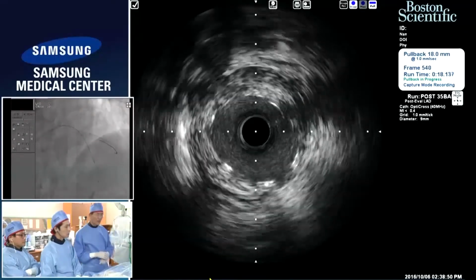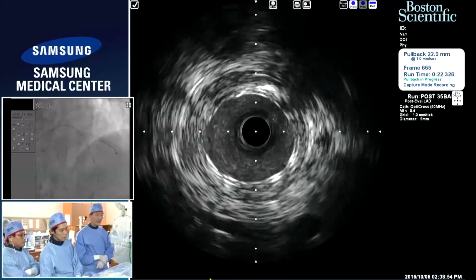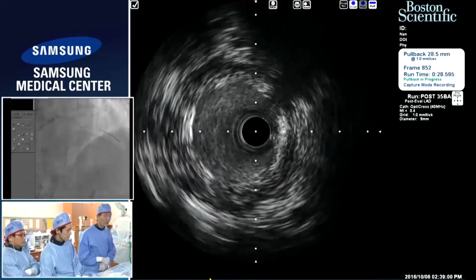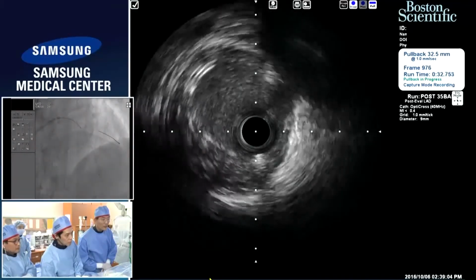OCT, how much time do we have? 20 minutes left. How long do you have? Actually, we can check the OCT for you.